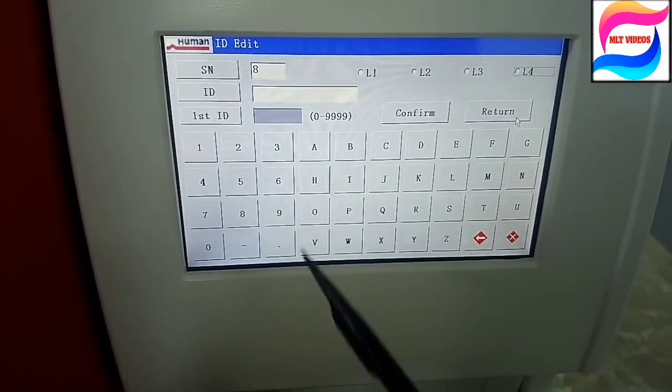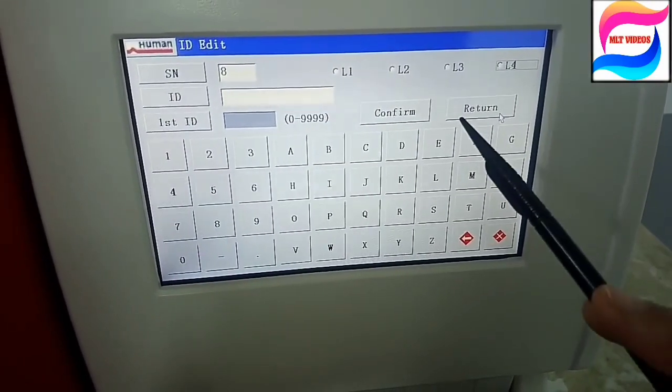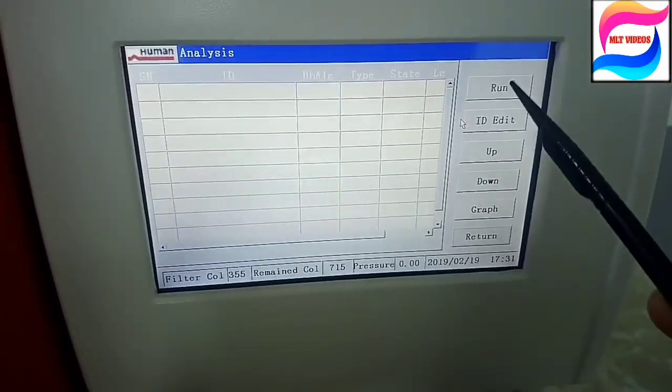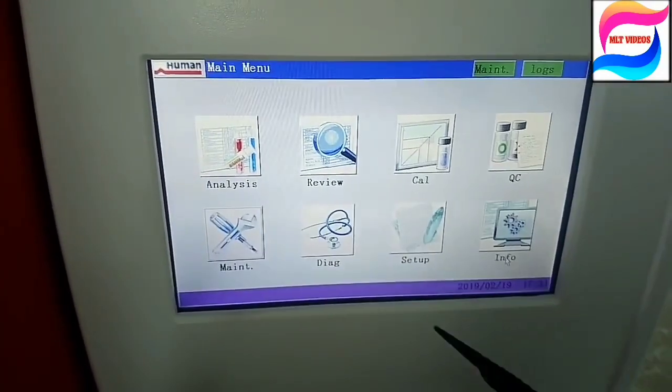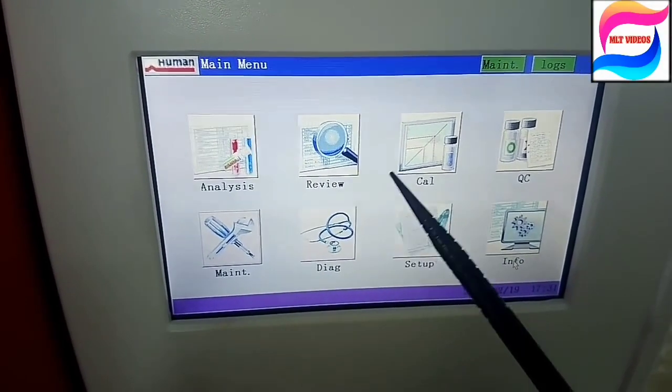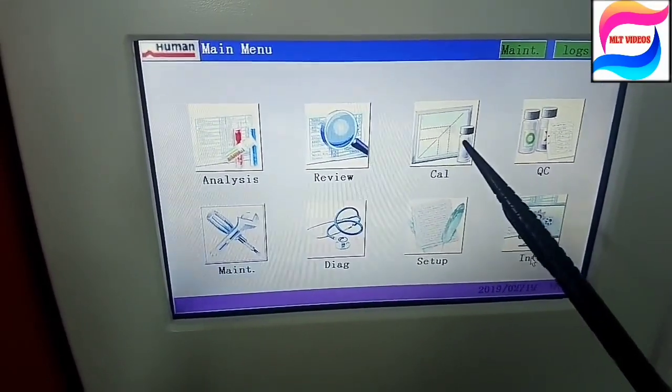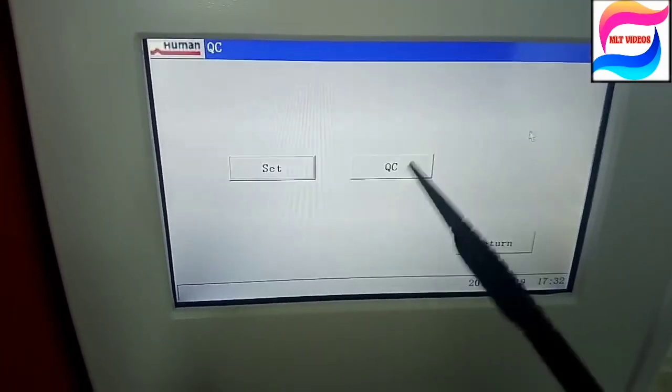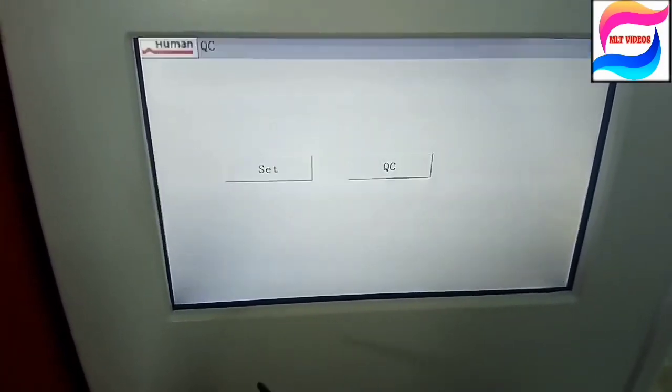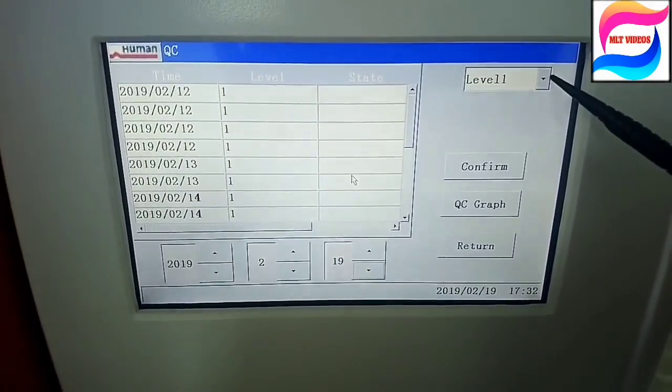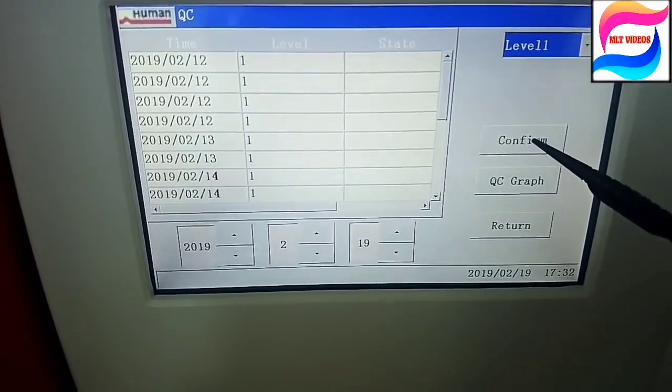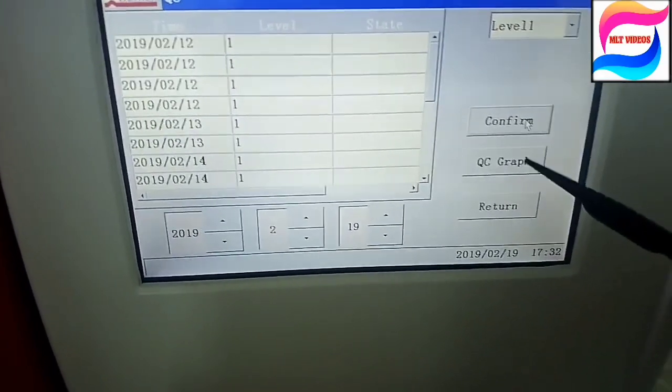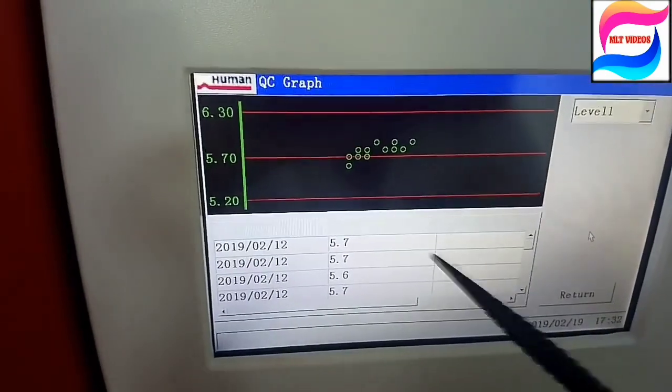Like that we will go ID Edit. L1, L2, and L3, L4 is for controls and patient sample. We will just click ID and we will edit. In Review, the results will come. Whatever results we run, it will come in Review. Then Calibration is used for calibration. QC section is used for control editing and graph. We can set the normal ranges. In QC we will check the graph, but for QC running we will go in Analysis only.